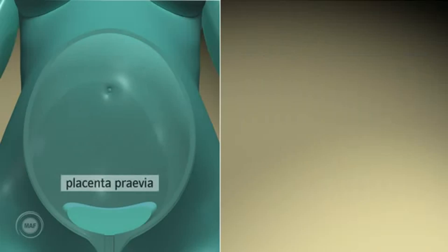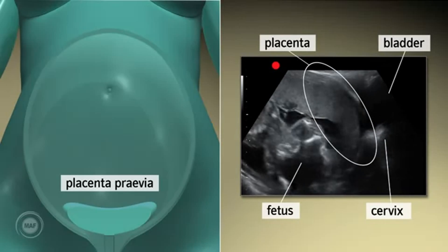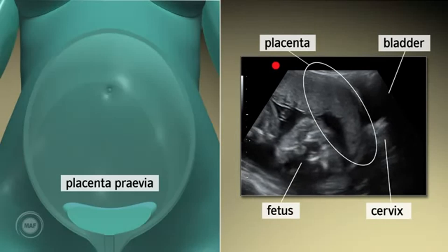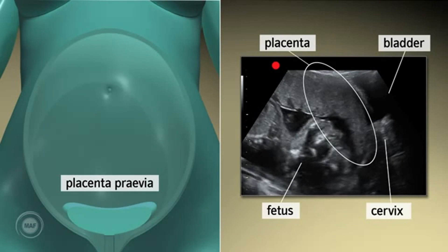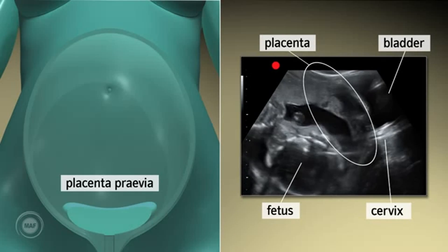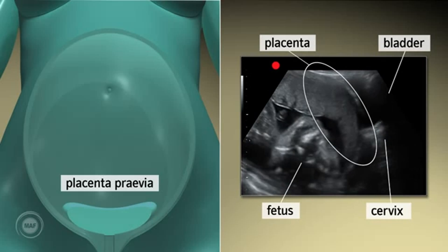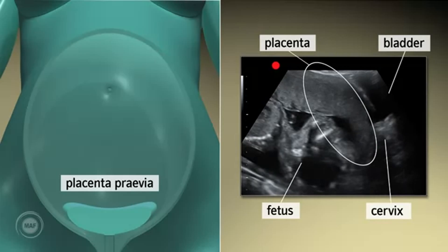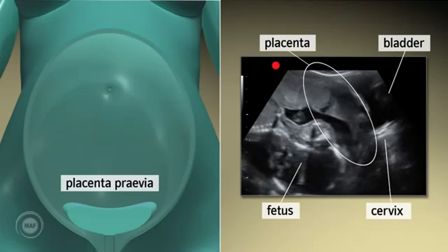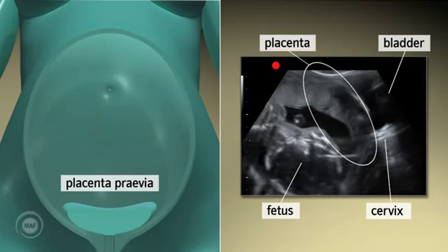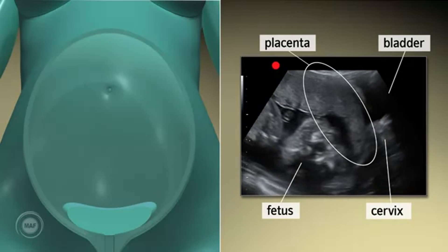Placenta previa. A low anterior placenta will appear between the bladder, which is seen at the extreme right of the screen, and the fetus on the left.